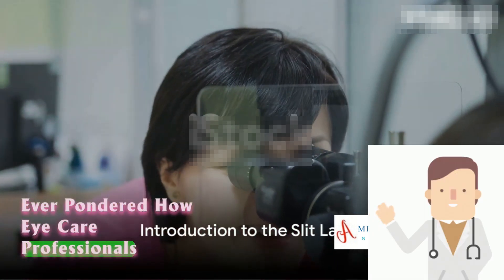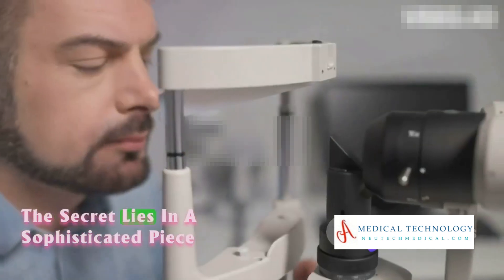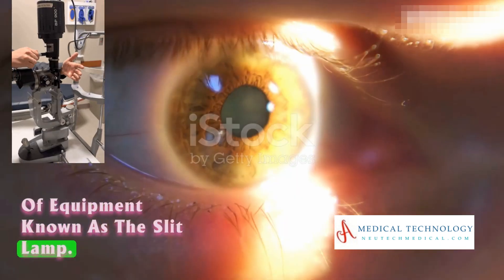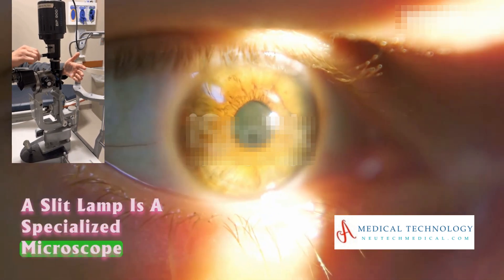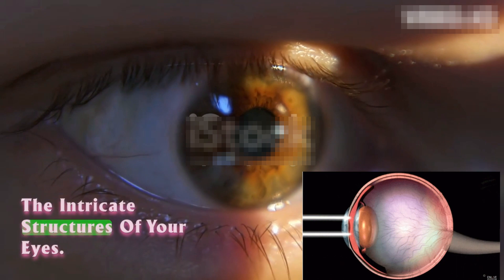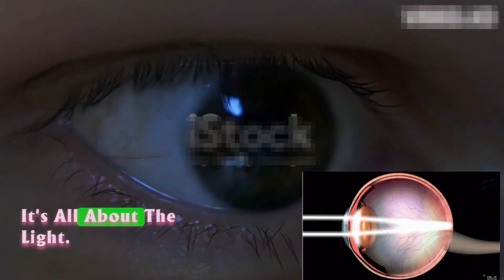Ever pondered how eye care professionals scrutinize your eyes in such detail? The secret lies in a sophisticated piece of equipment known as the slit lamp. A slit lamp is a specialized microscope that allows eye care professionals to examine the intricate structures of your eyes. How does it work, you ask? It's all about the light.